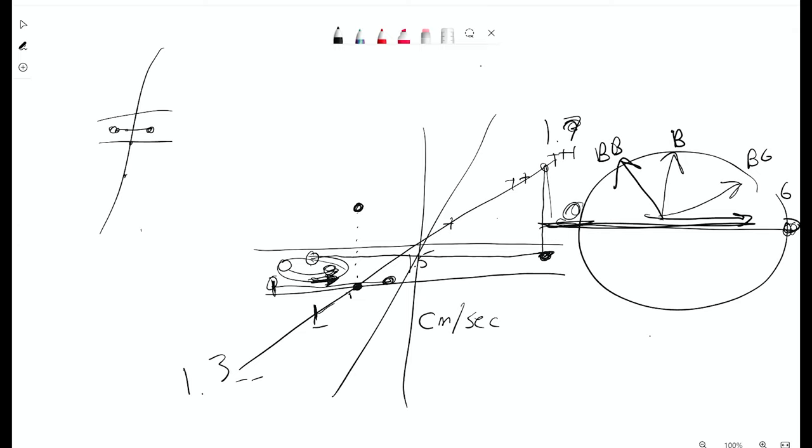This also goes into flow quantification as well, right? Because I can trust that this voxel is all blood, but this voxel here is half and half. You know what I mean? Right. And so let's say you actually had a 7 centimeters per second Venc here, and you had nothing here, it would average out to tell you that you had a 3.5 centimeter per second Venc. So you can't really trust those values.